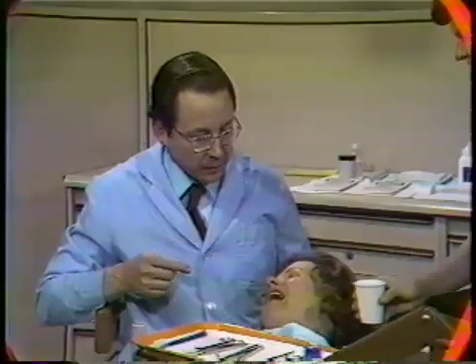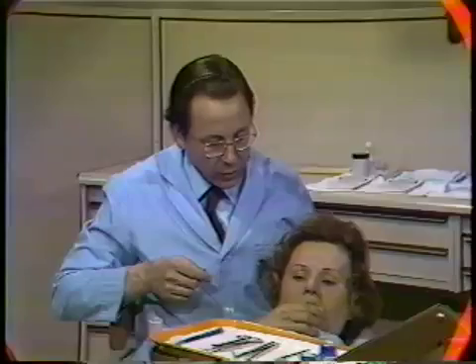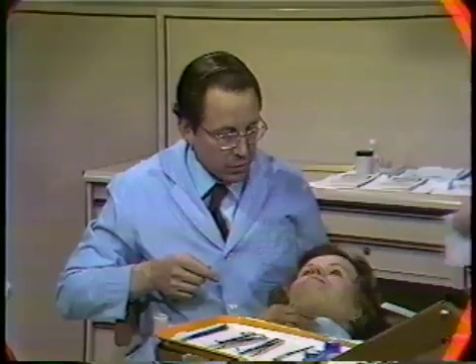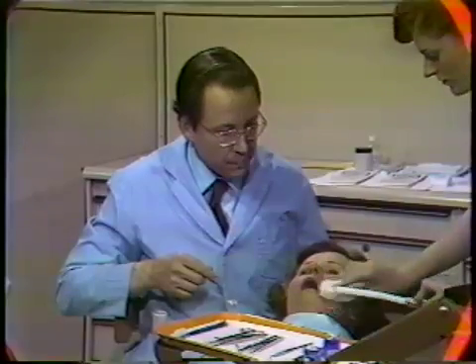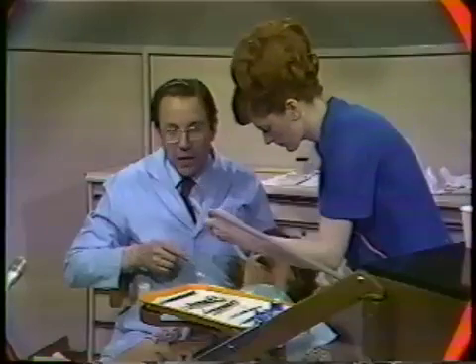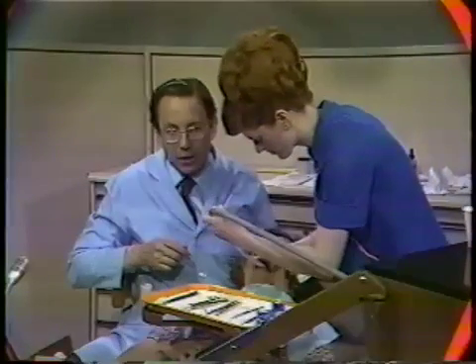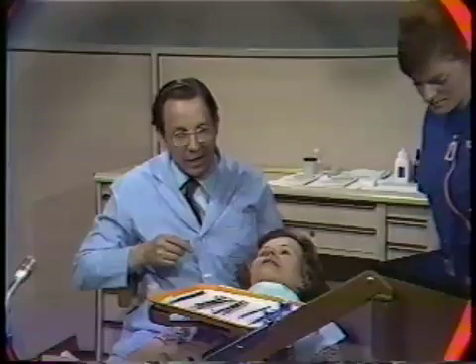3% hydrogen peroxide mixed with half warm water will now be used to rinse the mouth to further assist in removing the debris from around the teeth. After the mouth is rinsed with hydrogen peroxide, then a warm solution of plain water is used to get rid of the hydrogen peroxide and the taste of the xylocaine.